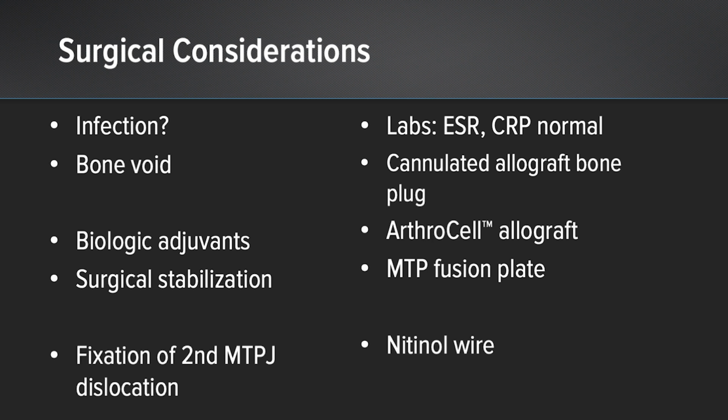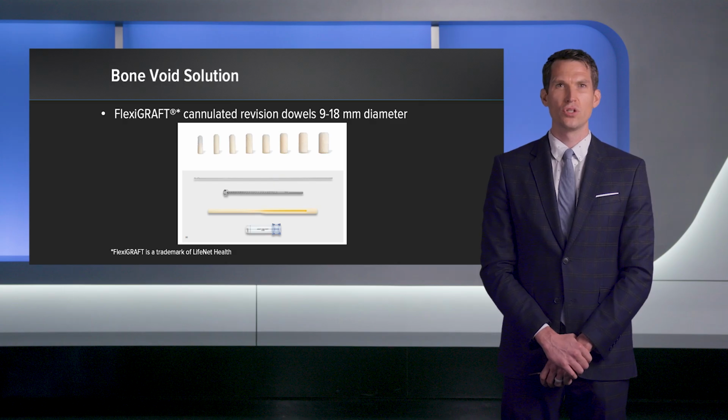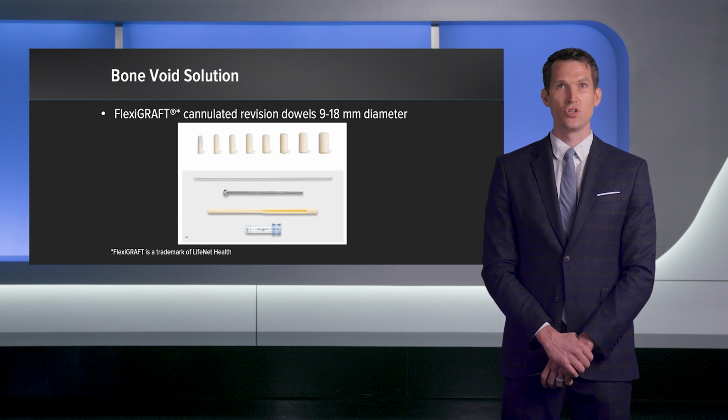Surgical stabilization, we selected a metatarsophalangeal joint low-profile fusion plate with locking screws. Metatarsophalangeal joint dislocation. Our plan was to use a nitinol wire to avoid any risk of the wire breaking intra or post-operatively. Our bone void solution was an Arthrex cannulated revision dowel.